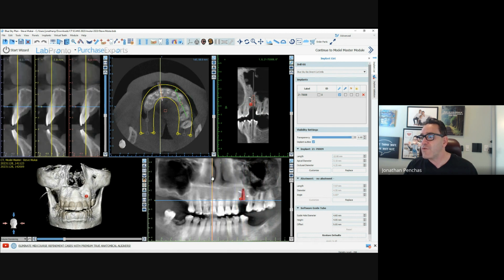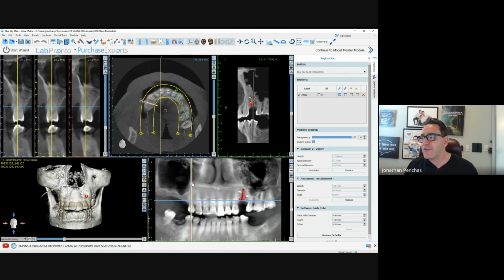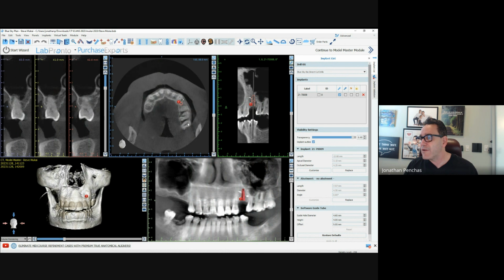One of the things you cannot do with CT, and I see a lot of doctors saying you have decay, you have a cavity, is diagnose cavities. Cavities usually cannot be diagnosed on CT. So tooth pathology in terms of dentin and enamel cannot be diagnosed very well on a CT. Don't try. That's the wrong thing to try and diagnose. But endodontics in terms of finding MB2 and things like that are very, very helpful.